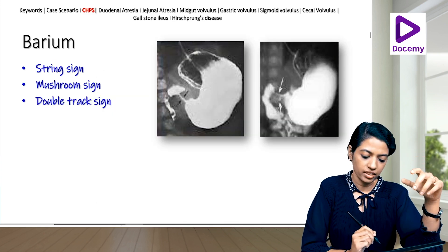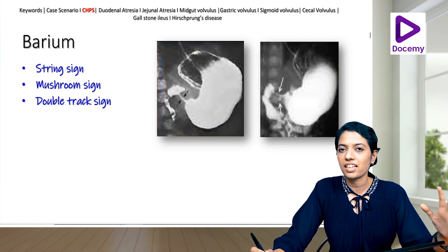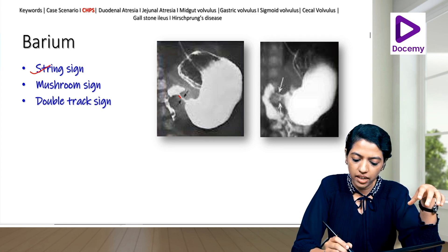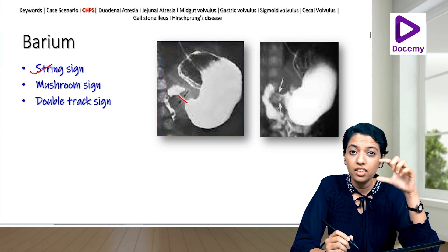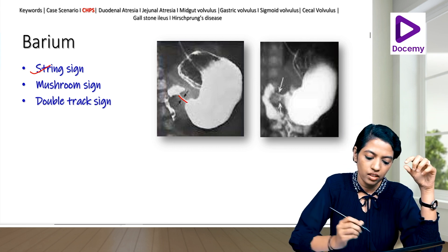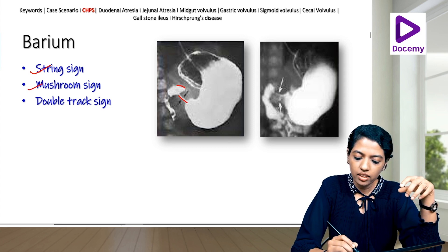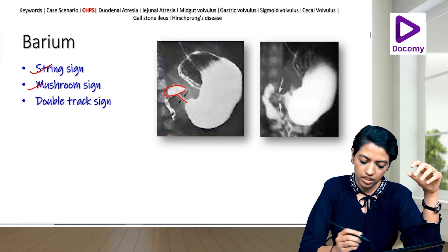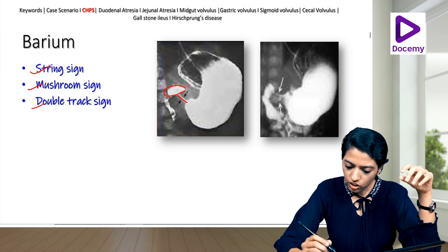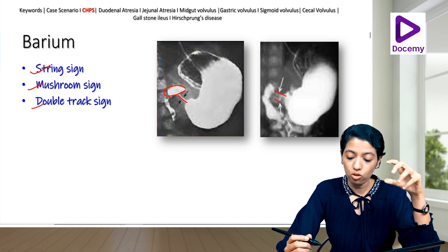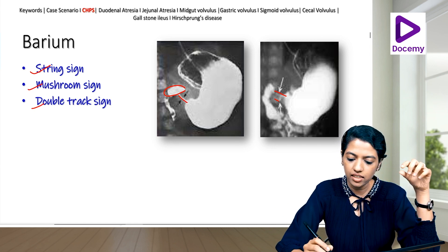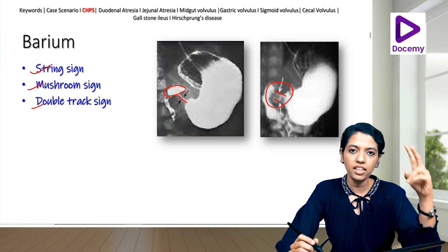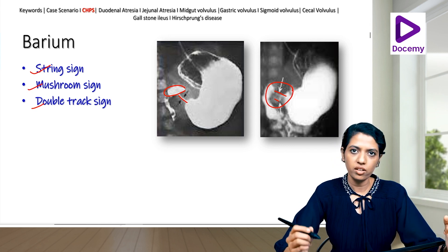There are three barium signs described in CHPS. First is the string sign — a narrow string of barium traversing through the thick gastric pyloric musculature. Second is the mushroom sign — this string with the dilated duodenal bulb forms a mushroom shape. Third is the double track sign — barium trickling through crowded mucosa is demonstrated as parallel lines.